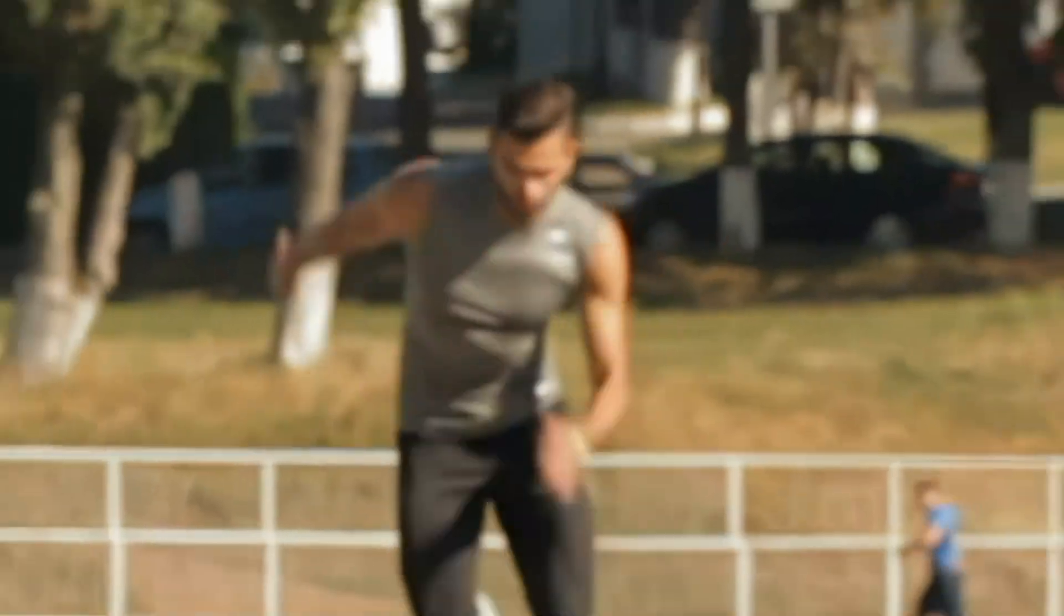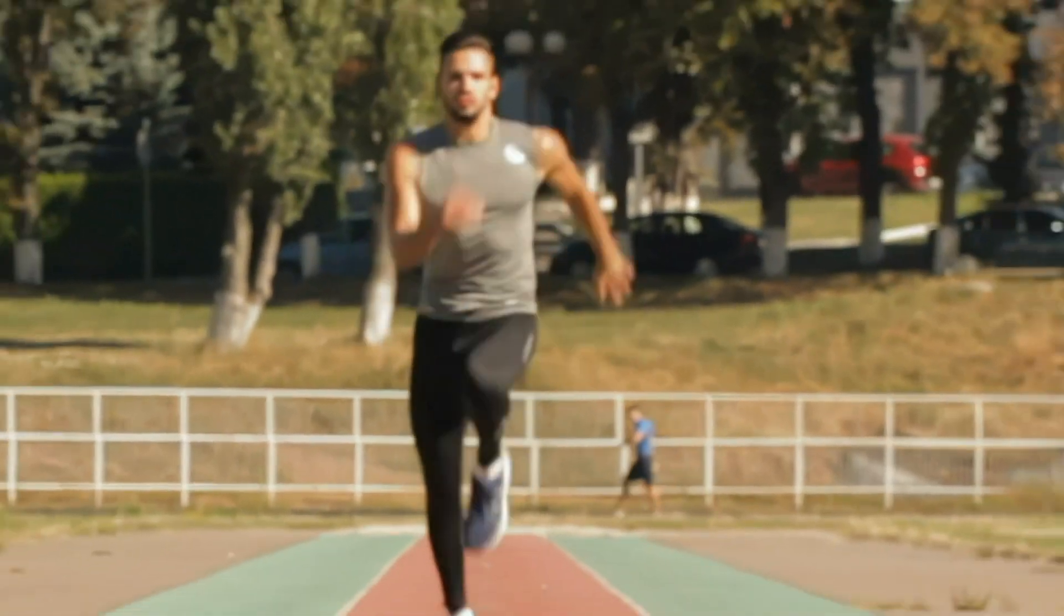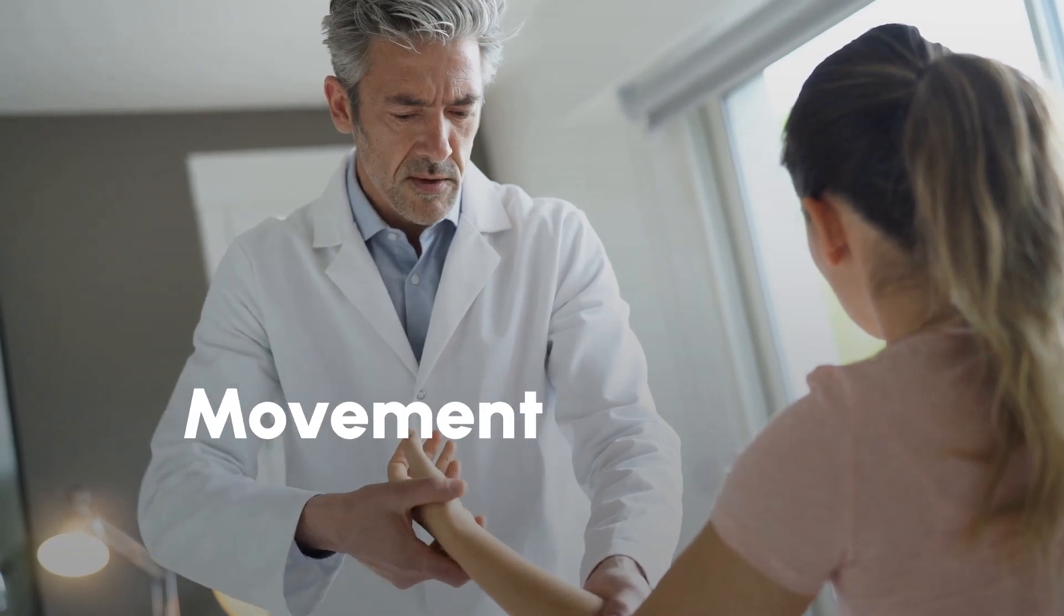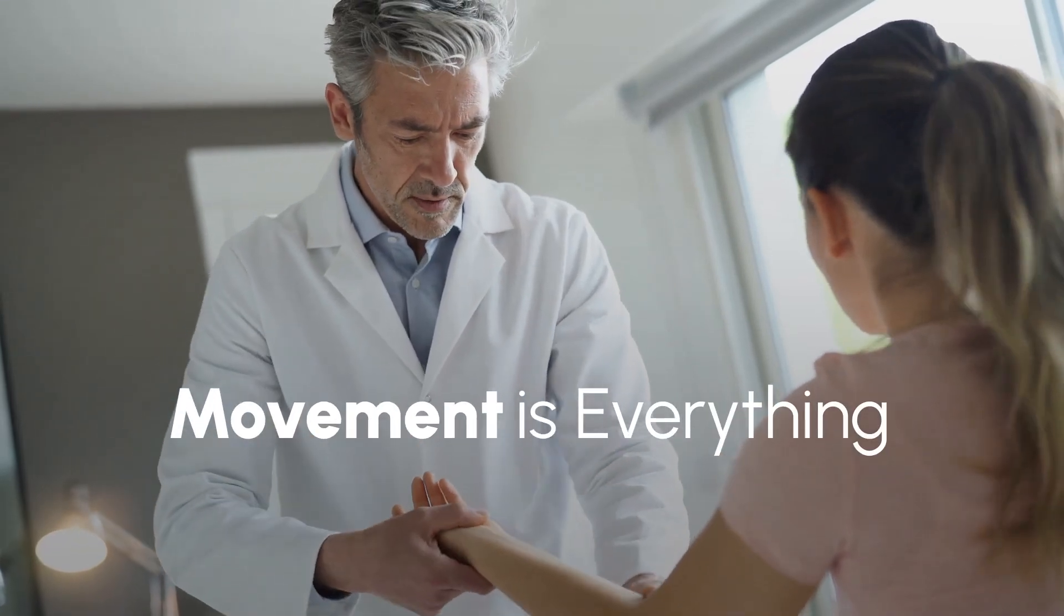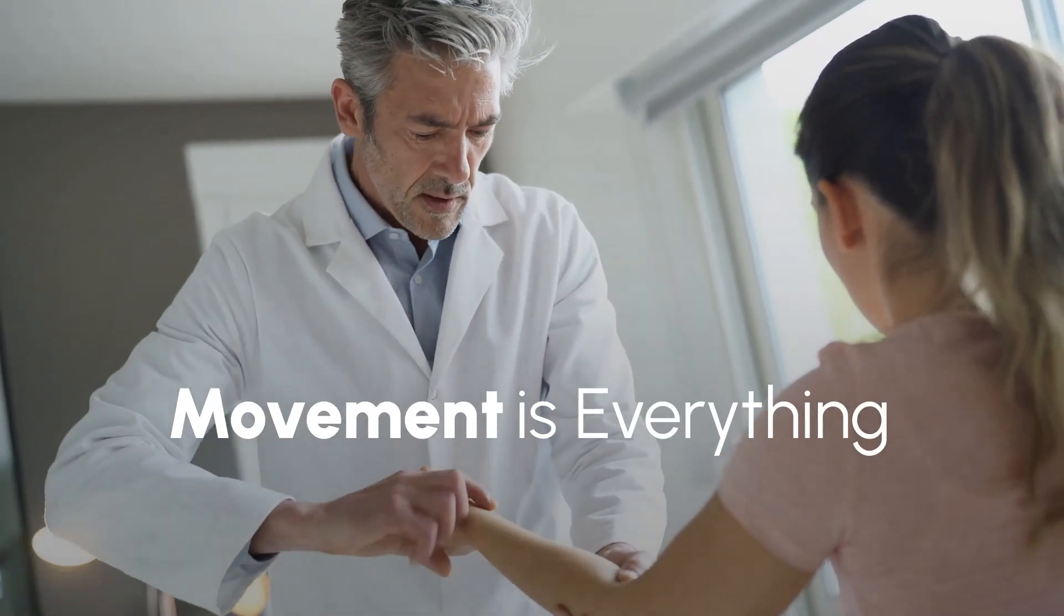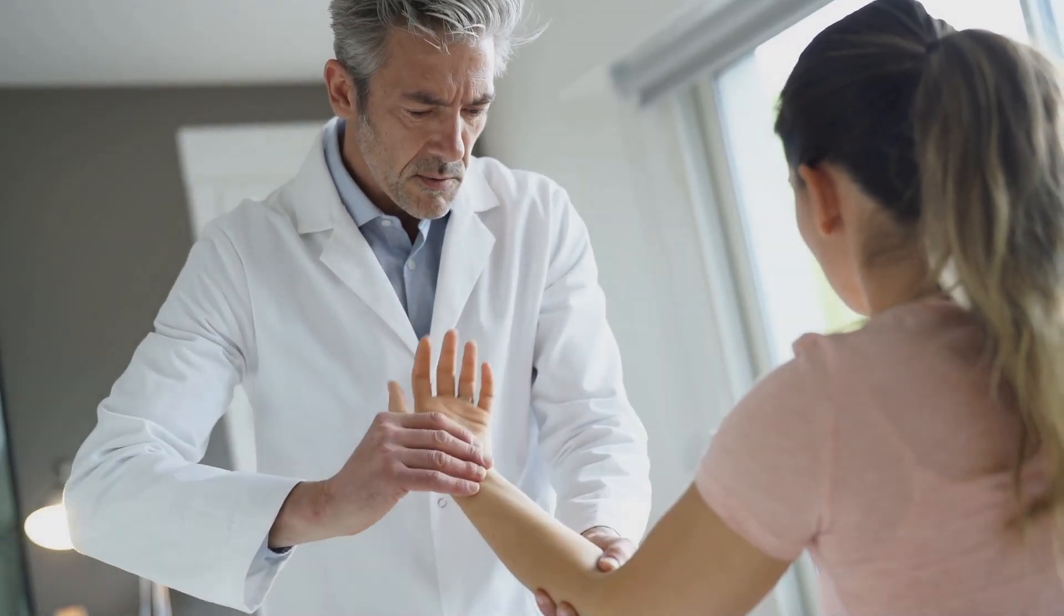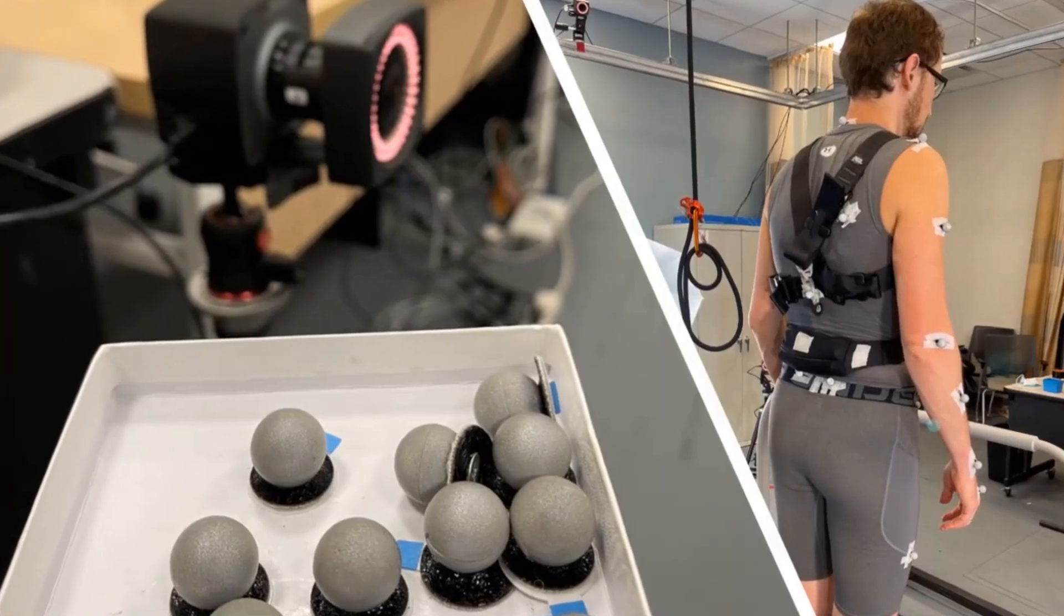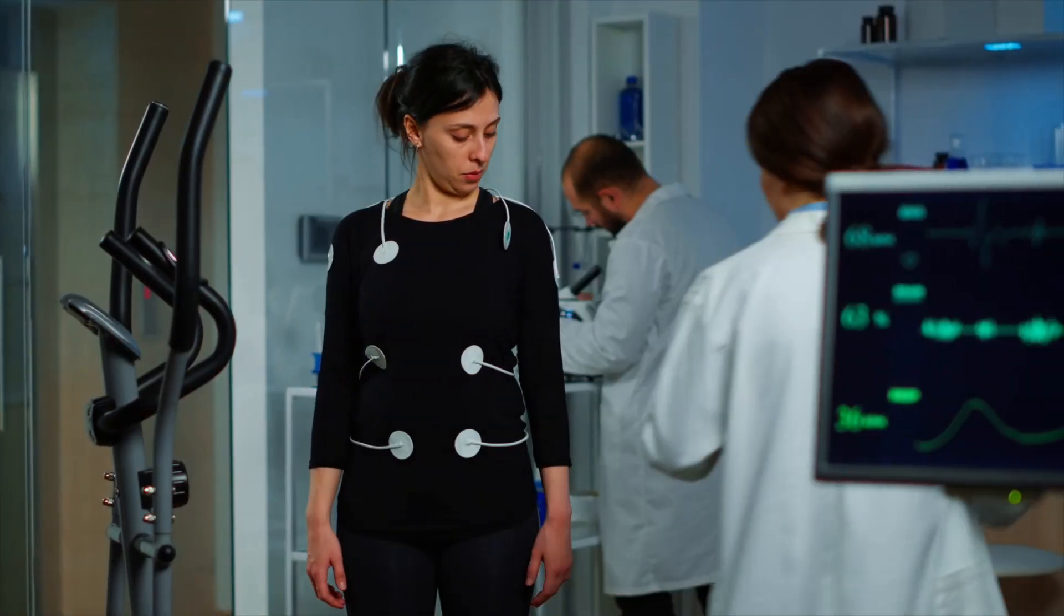For coaches, athletes, and clinicians, understanding human movement is everything. But for decades, precise biomechanical analysis required expensive lab equipment.